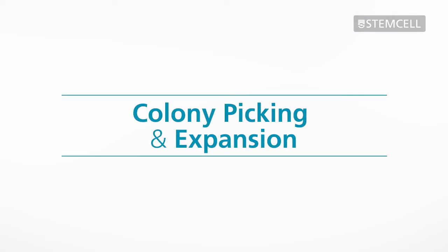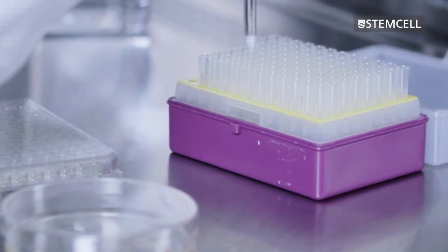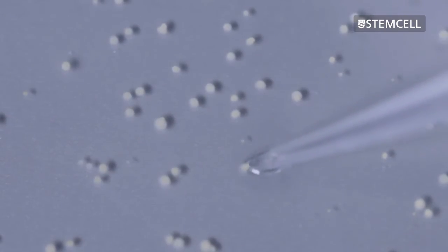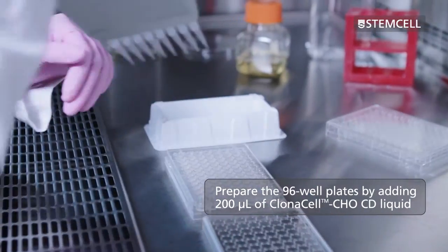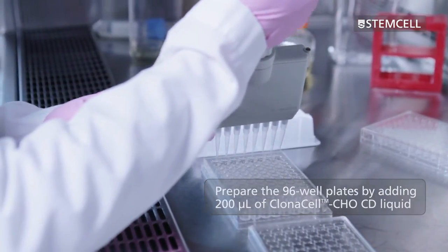Colony picking and expansion. After 10 to 14 days of undisturbed incubation, individually suspended cells will have grown into discrete colonies in the semi-solid medium. The colonies then need to be transferred to individual wells of a 96-well plate for expansion in liquid medium. Prepare the 96-well plates by adding 200 microlitres of liquid medium, such as Clonacell CHO CD liquid, to each well.